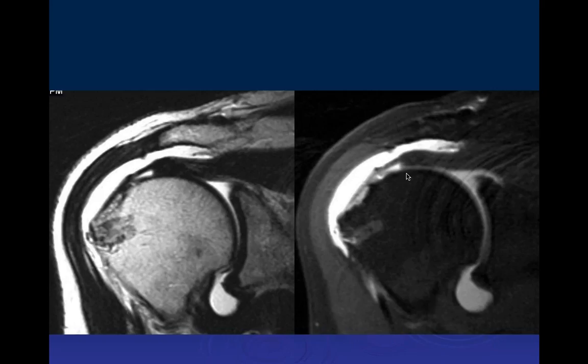Here's a case where we can see, here's the supraspinatus tendon. The musculotendinous junction is over here near the glenoid. It should be over the 12 o'clock position, so that's been medially displaced. This is actually the distal end of the tendon here, and what we see here is what looks like continuity of the tendon is scar in situ. And we can see this patient had a prior surgical repair with a suture anchor placed in the greater tuberosity.